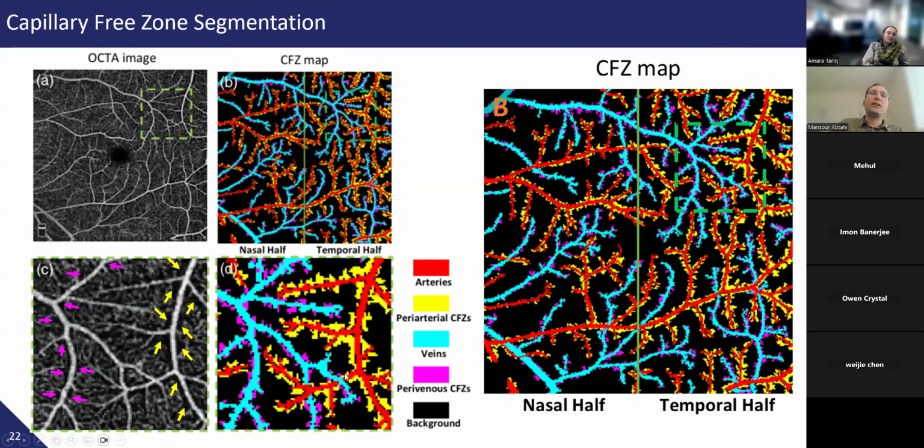You mean in this cross section here? Yeah. We can see it in the B scans, not in the en face images, and we use B scans to see which one is at the top.